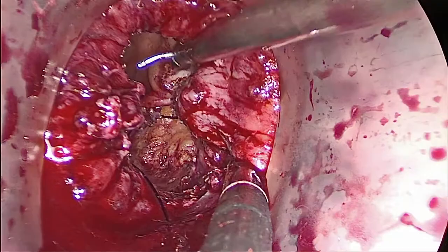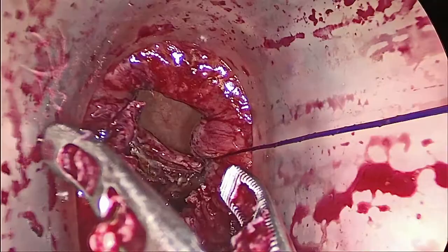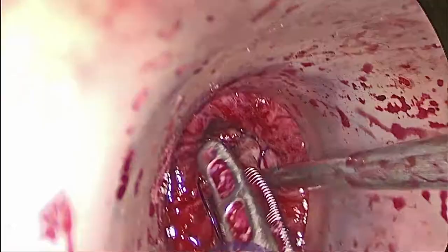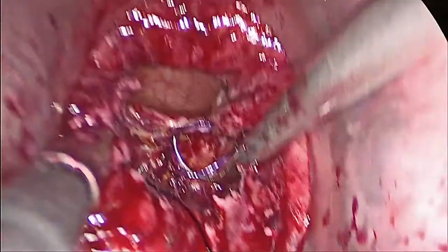Recent studies suggest that the transanal wall closure may not be necessary. In our experience, we have always closed it for hemostatic effect, but also for prevention of infection and abscess. Furthermore, we will evaluate the possibility of not closing the wall for a smaller lesion than the one shown.